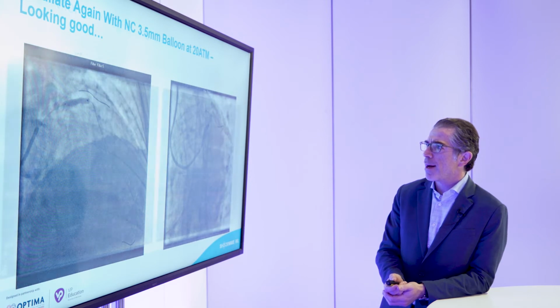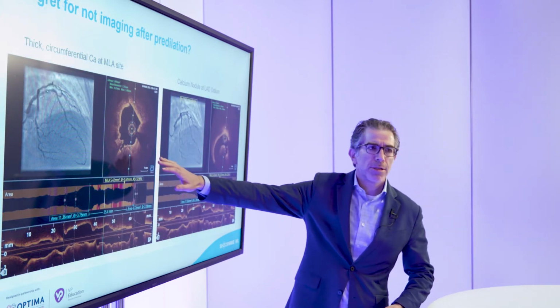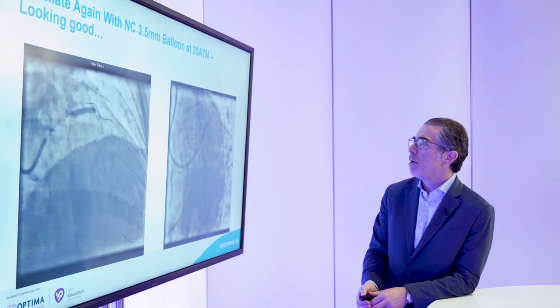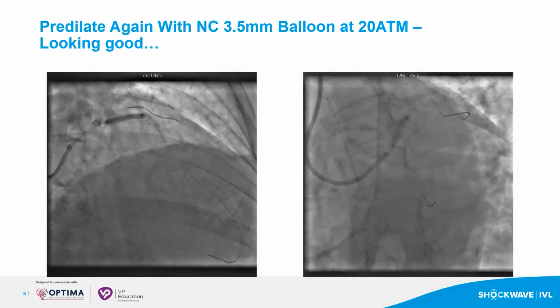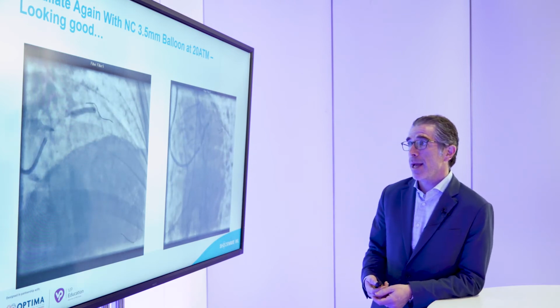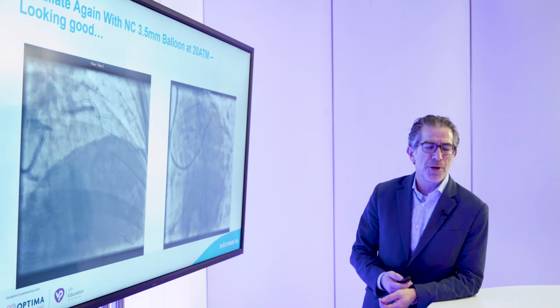I would also say, going back, you really see how thick the calcium was in this particular case. We had a really great case for IVL therapy. So just to be conservative, I pre-dilated with a 3.5 balloon. Now in the Disrupt CAD trial, you did not need to pre-dilate after IVL if you had a stenosis of less than 50%. There's nothing wrong with pre-dilating a little bit more.